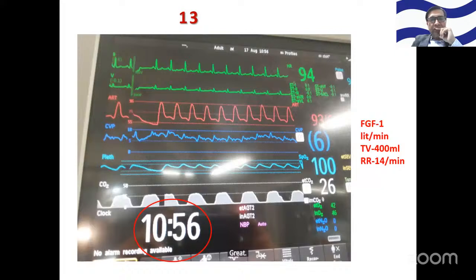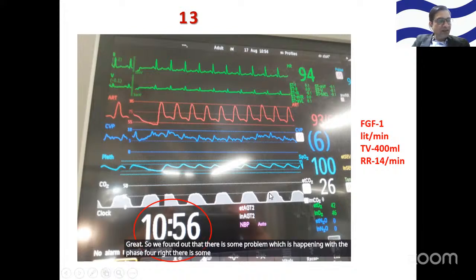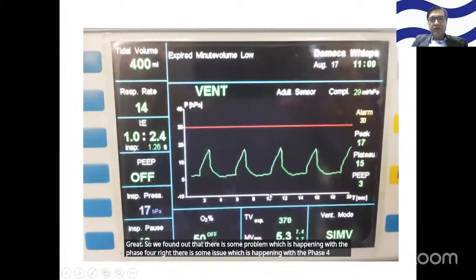So we found out that there is some problem happening with phase 4. We saw the ventilator parameters were looking okay, and the graph of the ventilator was also looking great, without any issues.